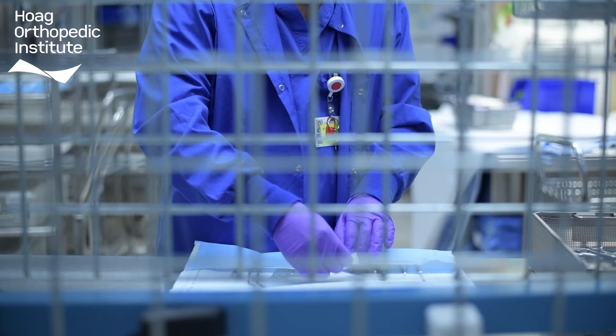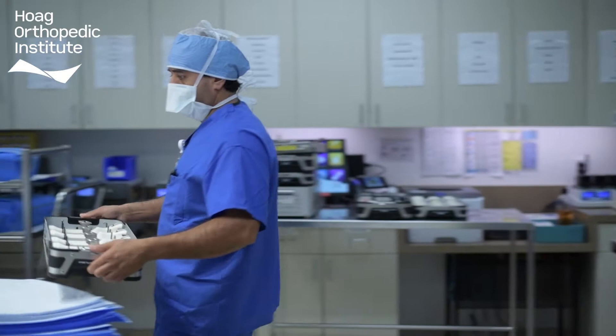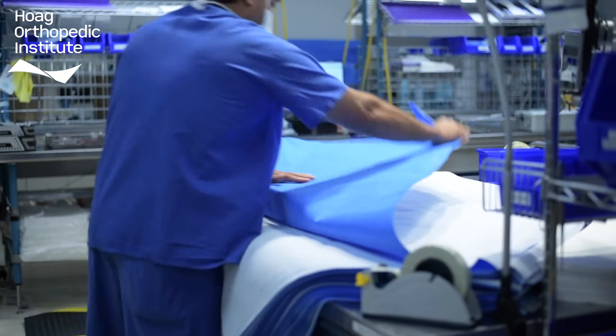From here, the instruments are prepared for sterilization by being placed into a metal mesh basket. The basket is then placed into a specialized container designed for sterilization. Some containers have a sealed hard outer shell and some must be wrapped with a specialized material called a blue wrap. Both containers are designed to allow the instruments to be sterilized and then remain sterile while being stored.